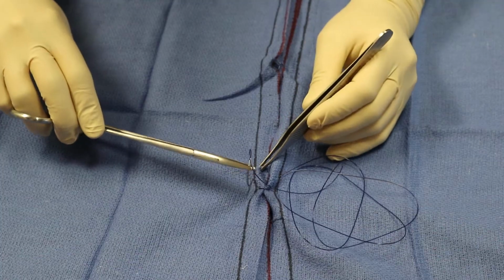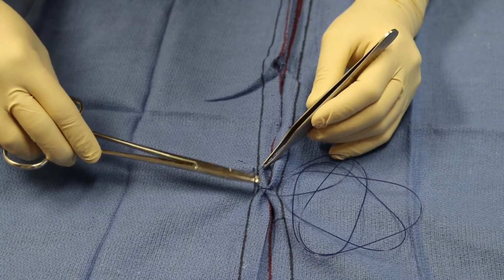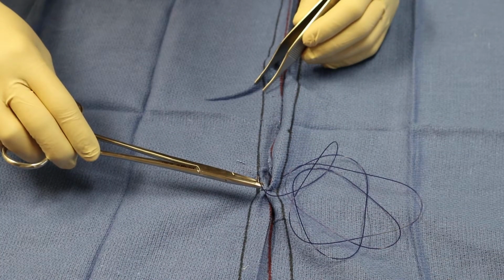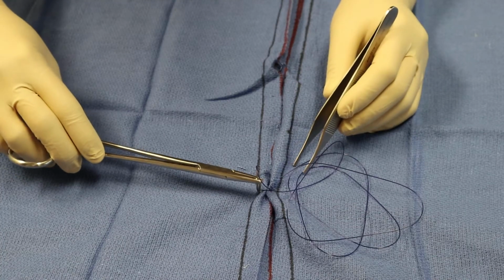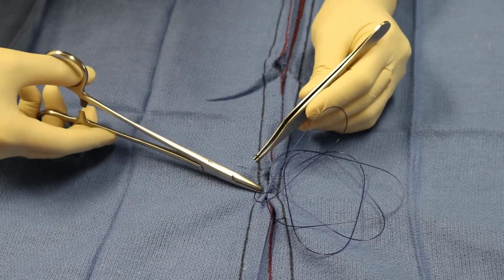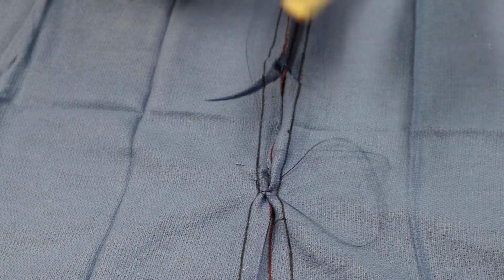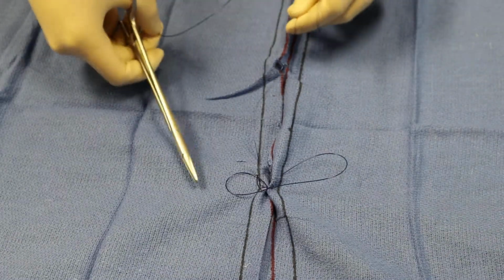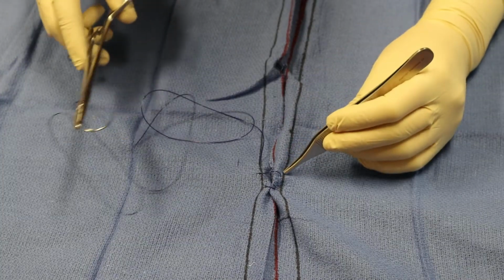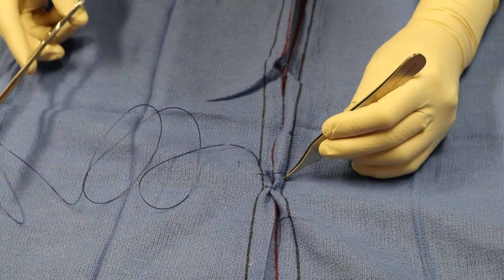Yeah, and with the Cushing and Connell, you can overlap slightly. So go back just a little bit from where your incision started, but you don't want to go back too much or forward too much because you'll cause a leak. So I think where you went in right there was great. Okay. And the same thing, then your next bite is directly across and back just a little bit to create that seal. So, like right here, like right here. Sure. Okay.